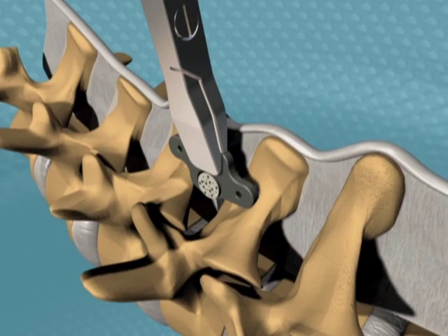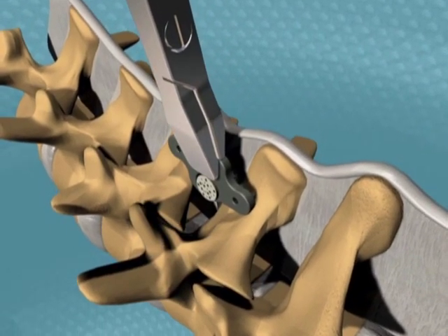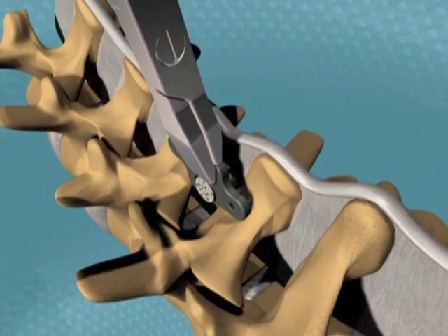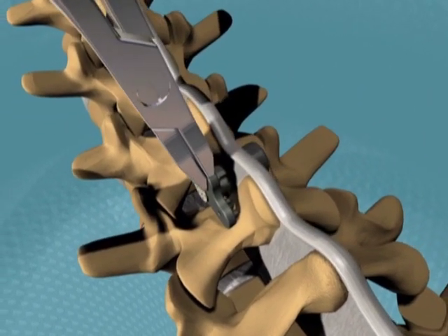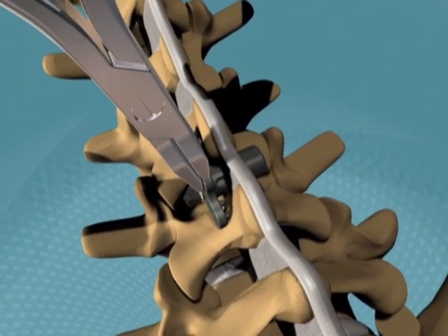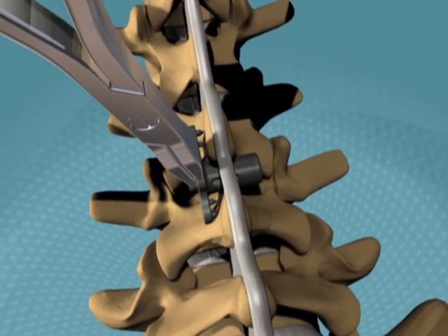It is important to note that the implant may be placed from either the right or left side of the patient. It is anatomically preferred to be placed from the left. If doing a multi-level placement of the Aspen, the implants should be placed cephalad to caudad and implanted from the left.